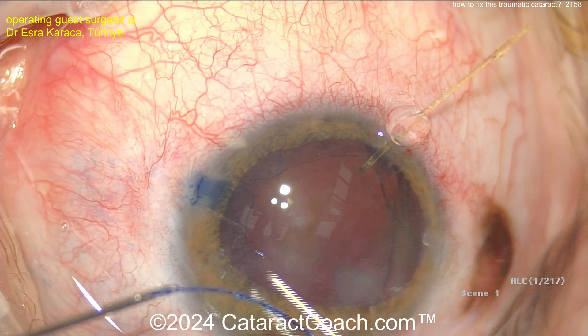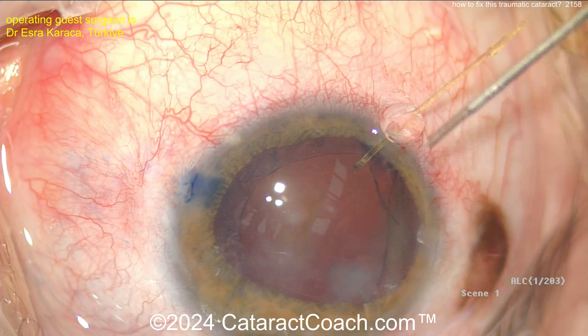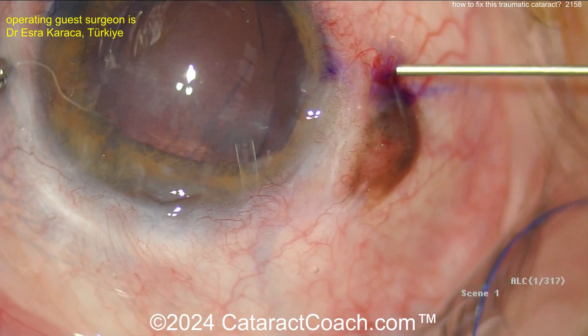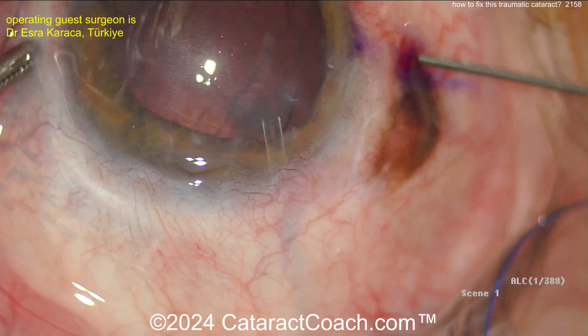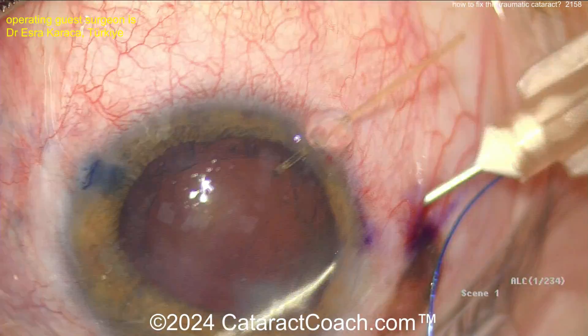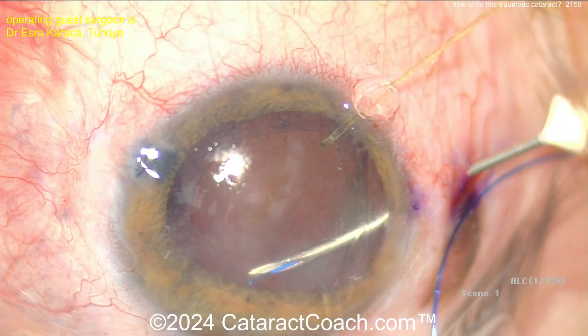A CTR — now a CTR being loaded up here into a cannula. Actually, it's a suture, not a CTR. That's a suture. So now passing a suture — it looks like a prolene suture, probably 6-0. A 6-0 prolene suture, bringing this needle now out of the eye. So now you've threaded a prolene suture.